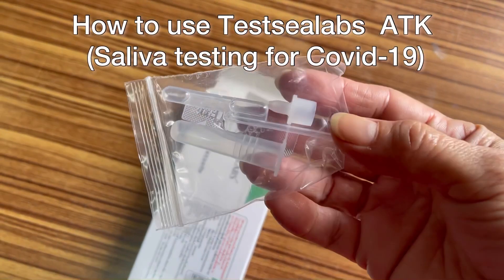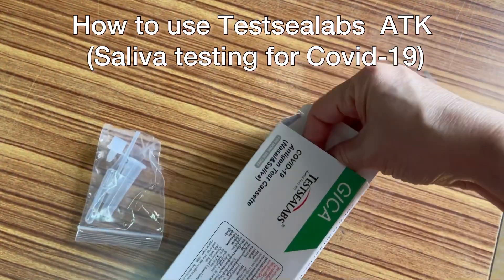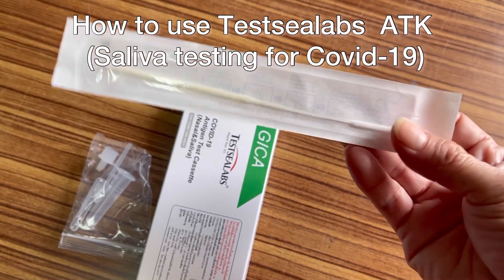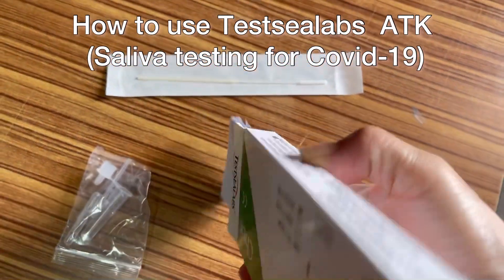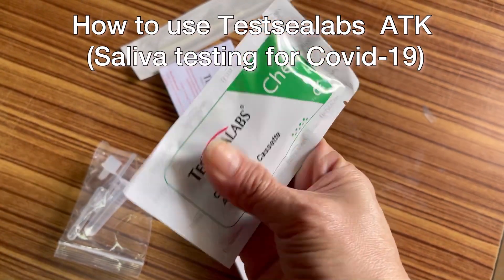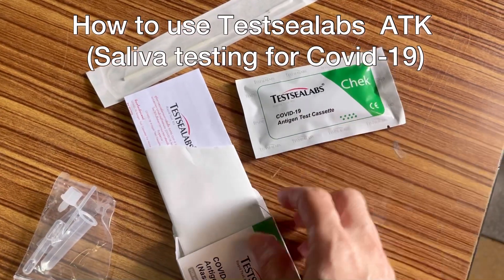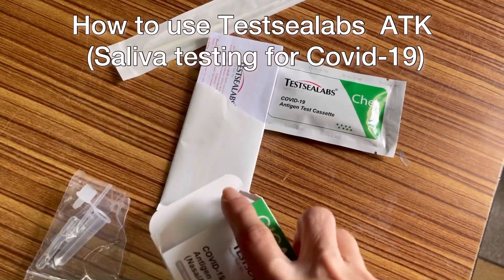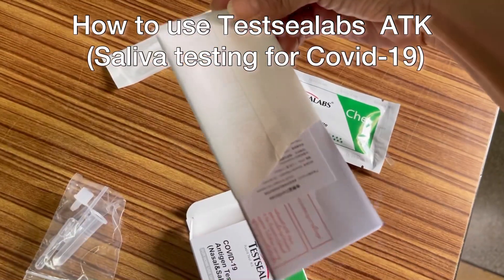This one is for saliva — if you want to test your saliva, you can use this. And this one is for the nose, to collect the specimen from your nose. Here's the test cassette — this is very important because you drop the specimen here and you can see whether it's negative or positive. And here's the pamphlet.